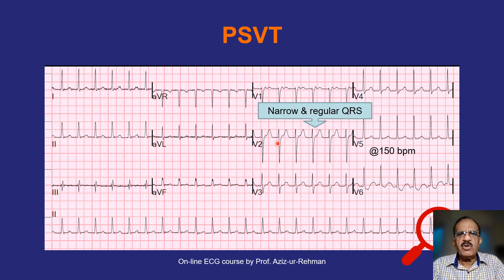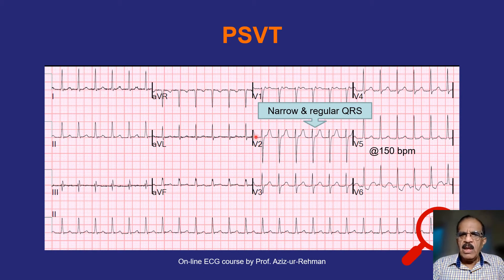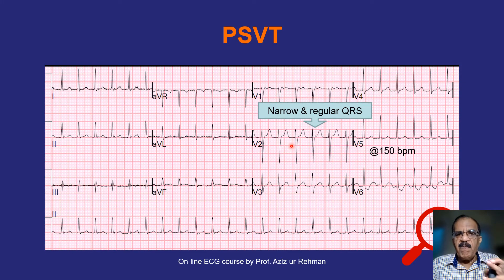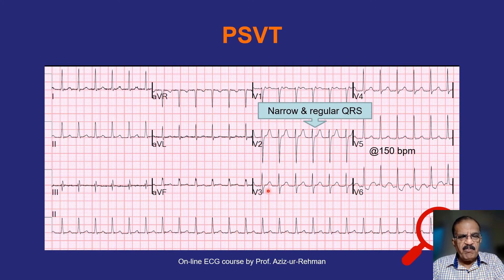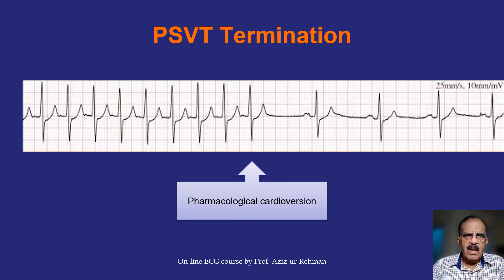This is SVT — possibly junctional tachycardia, since many SVTs are junctional. In paroxysmal SVT, you may see a P wave before or after the QRS complex; in this case it is after. In the majority of cases, the P wave is merged into the QRS and not visible, as was the case in the previous example. This is another example of paroxysmal SVT.